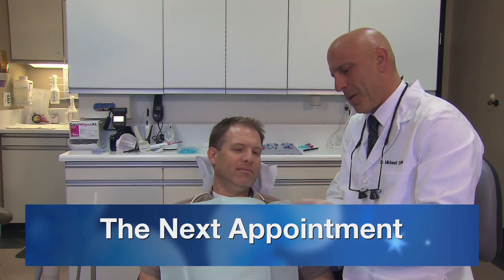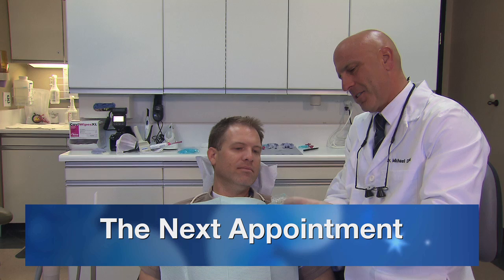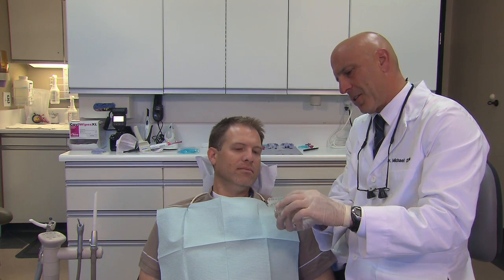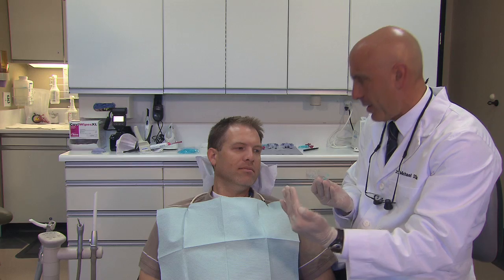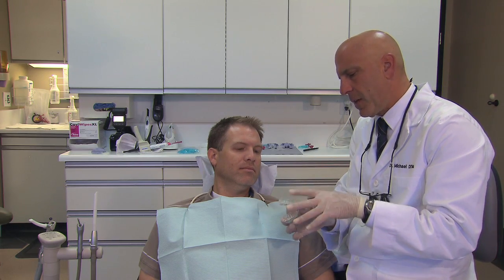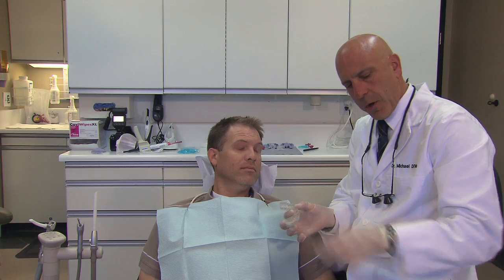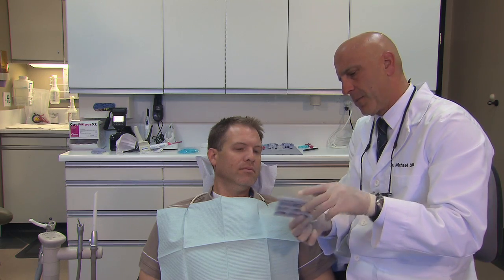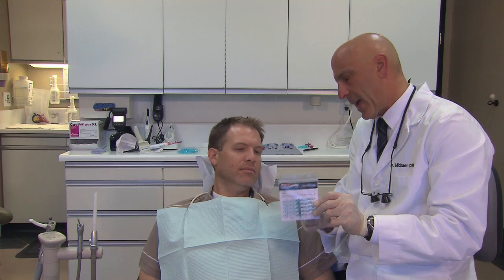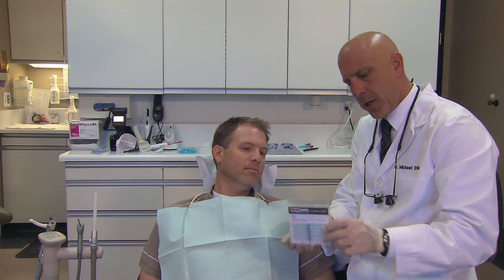It's been about 2 weeks, and it's time to go ahead and deliver the appliance to the patient. The first thing we do is a lot of talking in the beginning, just explaining to them. Again, remember the Silent Nite SL is an appliance that for the most part the patient's going to adjust at home, so we want to make sure they have an understanding of how it's going to bring the lower jaw forward, how that's going to open the airway, how the straps work, how to put it in, how to take it out, and all those kinds of things.